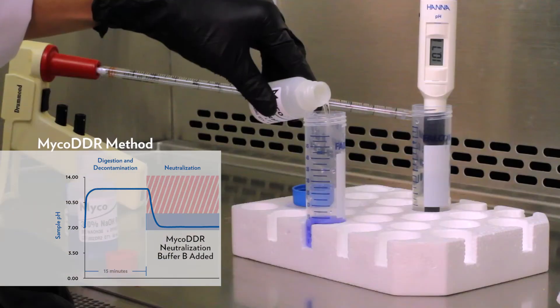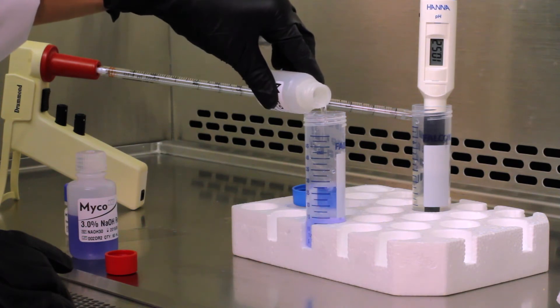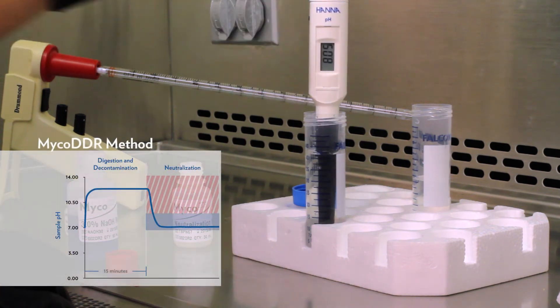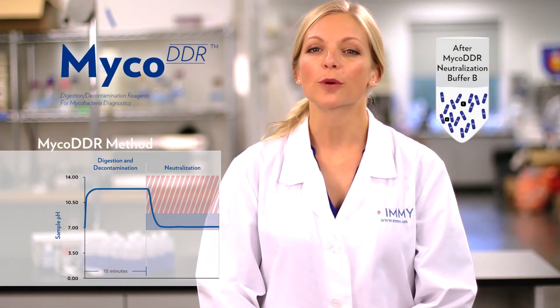The next step is to add the Myco DDR neutralization buffer B, which has an extremely high buffering capacity — much higher compared to m15 phosphate buffer. When adding neutralization buffer B, the sample will turn clear when it reaches a neutral pH. As you can see, when the sample turns clear, the pH is in the optimal range for mycobacteria survival.